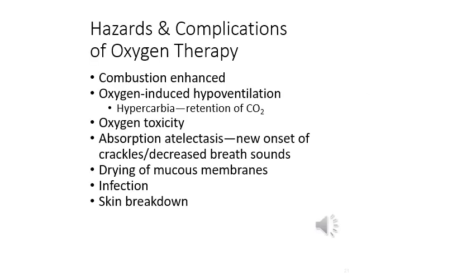Hazards and complications of oxygen therapy. So combustion is enhanced. It's definitely a fire hazard, so you want to keep away from any flame, cigarettes, candles, etc., and use grounded plugs to prevent electrical sparks while in the room. No frayed cords or increased concentration of alcohol. These are things you're going to want to be aware of when you're going into a patient's room.